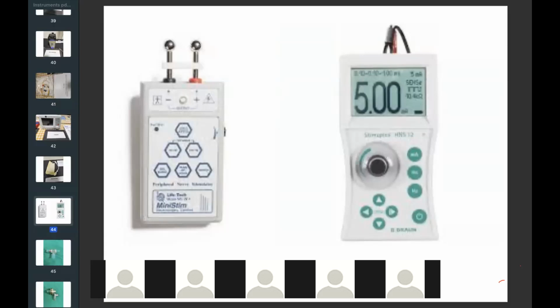So it is PNS, peripheral nerve stimulator, and it is used to monitor the degree of neuromuscular blockade. It is a battery operated device, and the stimulus which is displayed there is a monophasic square wave type. The most common nerve we monitor is the ulnar nerve, and we look for the adductor pollicis muscle stimulation. Also, we can monitor the facial nerve, common peroneal nerve, and the posterior tibial nerve. Usually we place two surface electrodes like our regular small ECG electrodes over the nerve and connect via leads to the nerve stimulator.